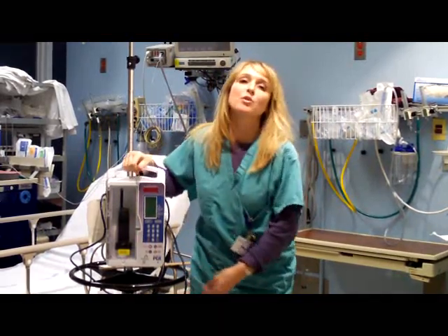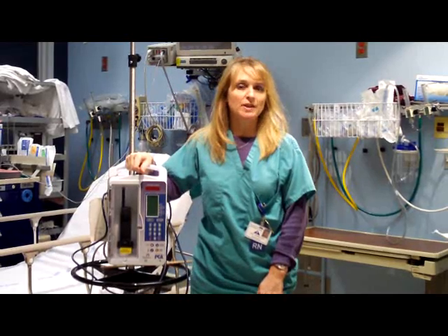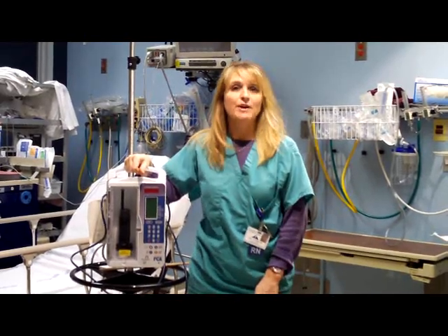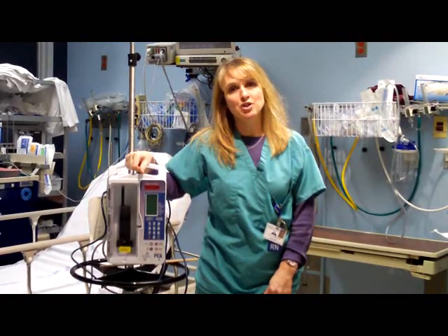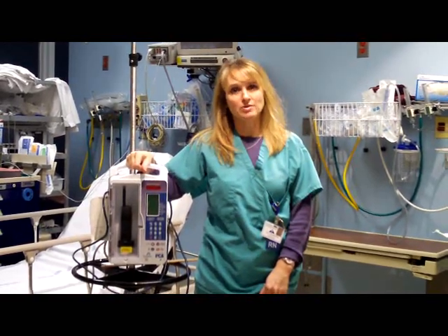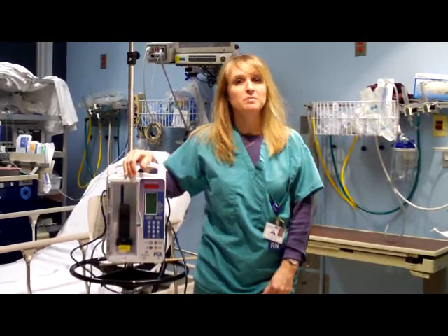The next component of the order is the lockout time, which is how often the patient can use it, and that's usually written in minutes. The final component is the 4-hour dose limit, which is the maximum amount of medication the patient can use within 4 hours. If that is reached, the medication will not deliver any more medication.